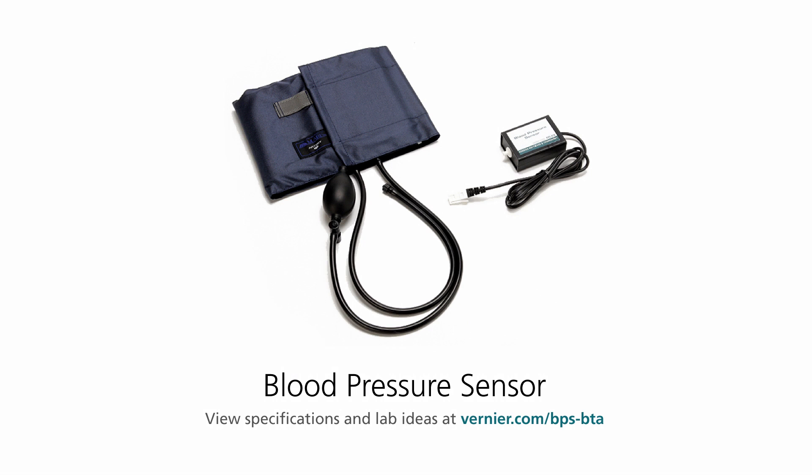Hello, I'm John Melville from Vernier Software and Technology, and I'm going to be talking to you today about how to use our blood pressure sensor. Our blood pressure sensor will give you key parameters of blood pressure, such as systolic blood pressure, diastolic pressure, and it will also calculate your MAP, which is your mean arterial pressure, and it will also give you your pulse rate.